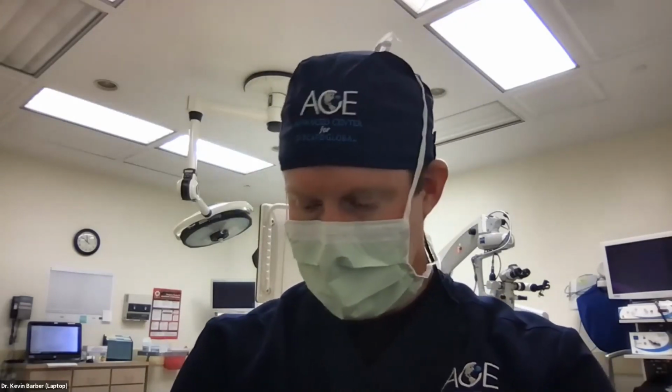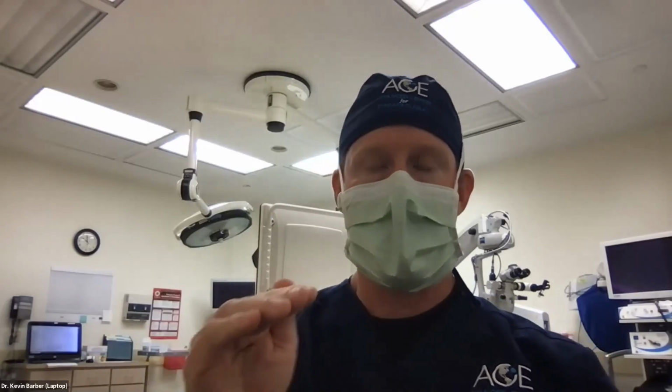Anytime we're talking about a new surgical procedure, that has to be part of the discussion, right? What are the risks? I would say early on, I caused some hyphemas by hitting the peripheral iris. I don't think I've caused irreparable damage where you've had to go in and fix an iris cleft or something like that. But the KDB has a tendency to want to go posteriorly as you advance it.